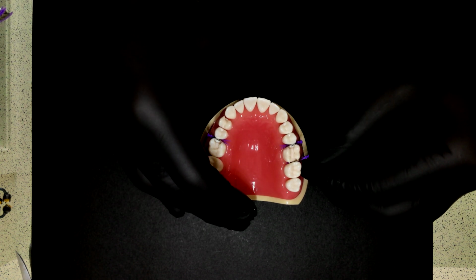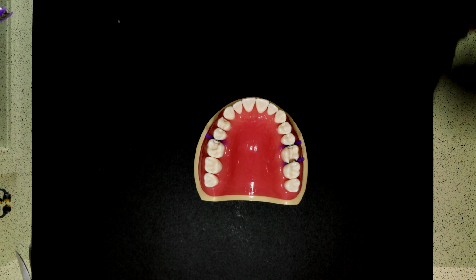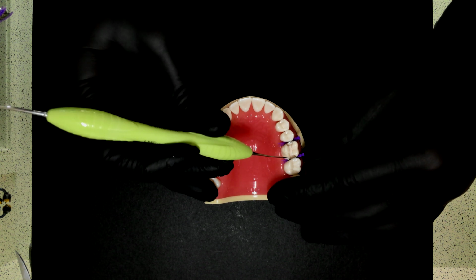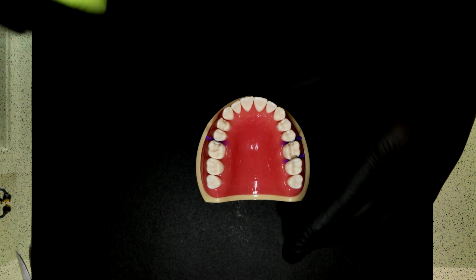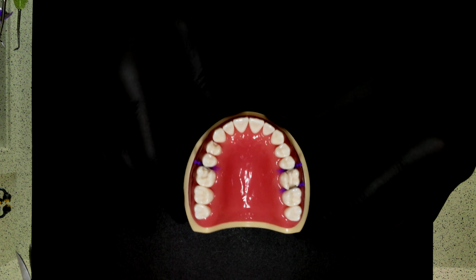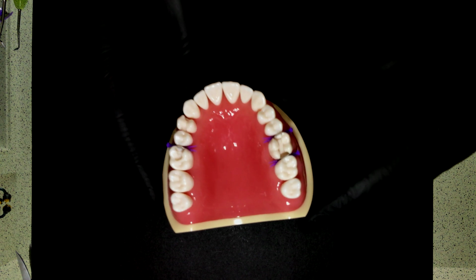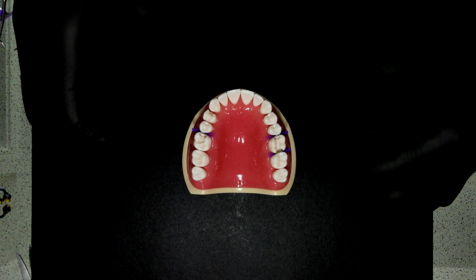When you get into molars or little tight embrasure areas, sometimes the leading edge of this matrix band may want to get caught up, and so if you feel that happening, just simply take an instrument and press the matrix band out, and then continue to push your matrix band in place to make sure that everything is seated. If we zoom in closely on this or bring it up to the camera, you can see that we have matrix bands, sealed preparations, and everything's ready to go in one quick step.